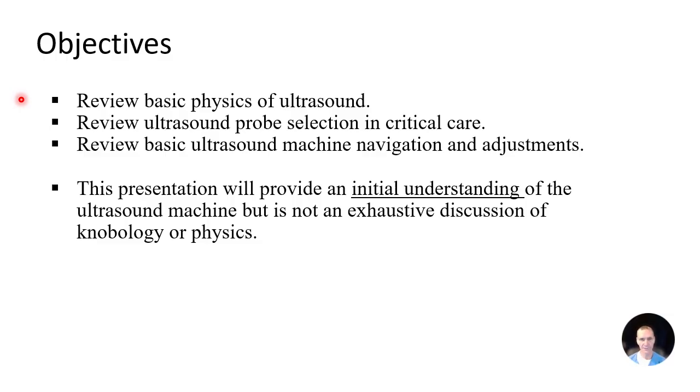Review the basics, physics of ultrasound, review ultrasound probe selection in critical care, review basic ultrasound machine navigation and adjustments. It's important to say this presentation is meant to give you an initial understanding of the machine. It's not an all-inclusive or comprehensive ultrasound physics lecture.